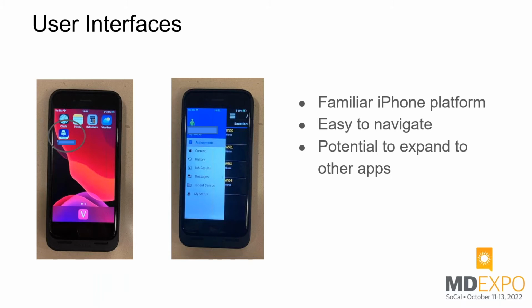So yes, we've done that due diligence, but from a code perspective, we have a different escalation for that. And like I said, I will have a slide on the escalation that we also have for this particular technology, in terms of what happens if you have a red alarm. It goes to the nurse, the PFC, which is our patient flow coordinator. And then if that doesn't get responded to within a certain time, it then escalates to everybody. It's different for yellows and of course different for the blue level alarms.